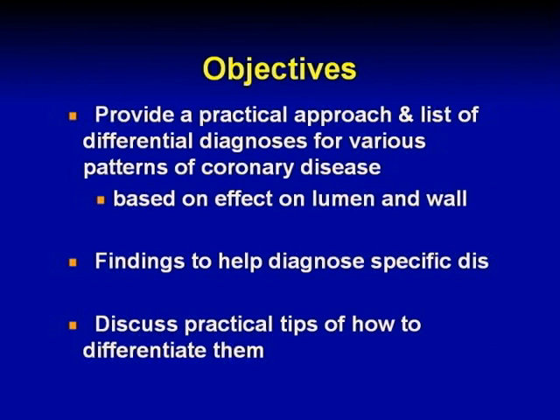So the objectives of our talk are three here. The first one is to provide a practical approach and list of differential diagnoses for various patterns. And I'm going to base this on the effect of the disease on the lumen and the wall, try to describe the findings to help diagnose specific disease, and discuss practical tips of how to differentiate these various diseases.